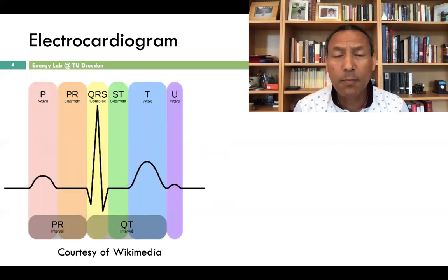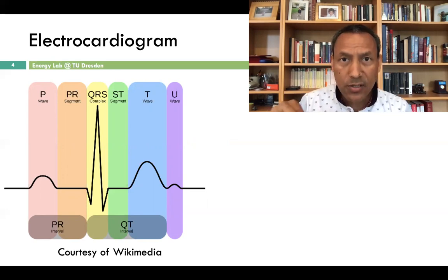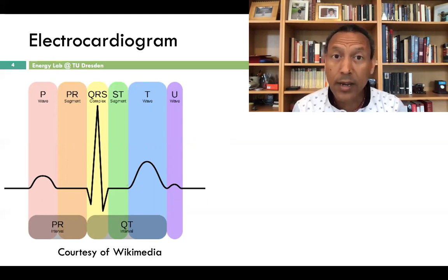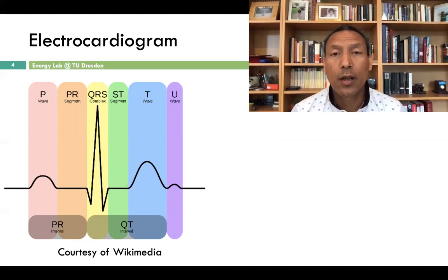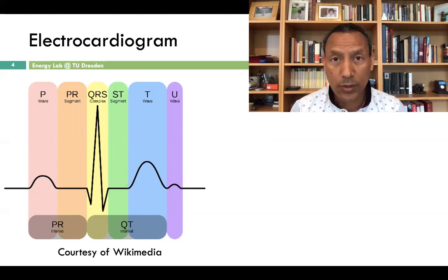The electrocardiogram, you might be familiar with it, looks like the following. It has three main hills or waves and a silent period between these waves, and each has a meaning: the amplitude of the signal, the shape of the signal, and the distance between the waves have a very useful meaning, and doctors usually analyze this to determine what is wrong with the heart.